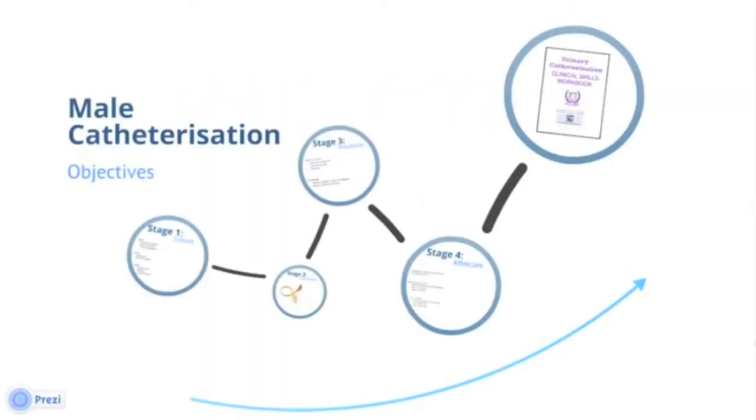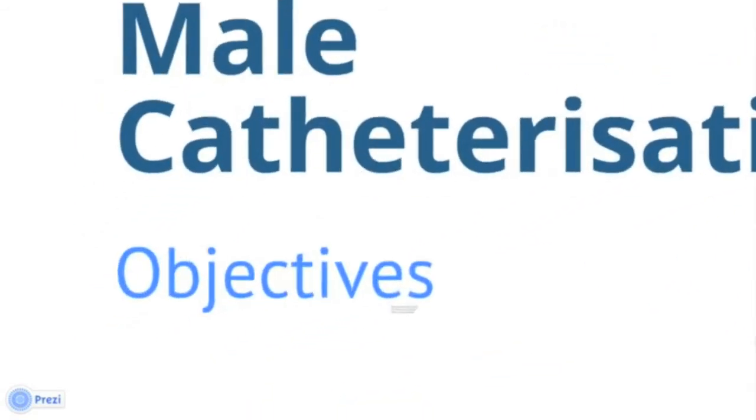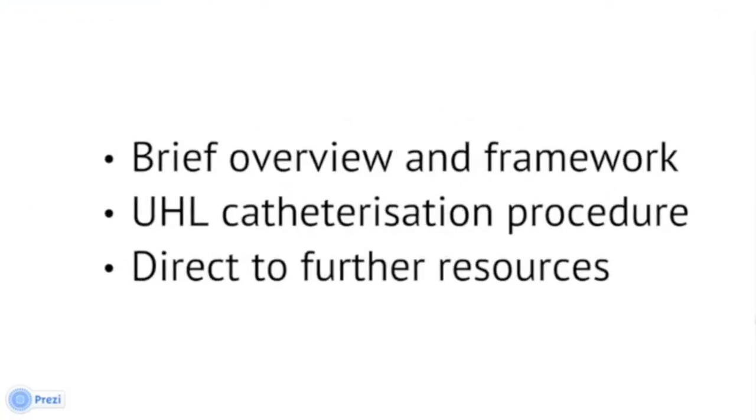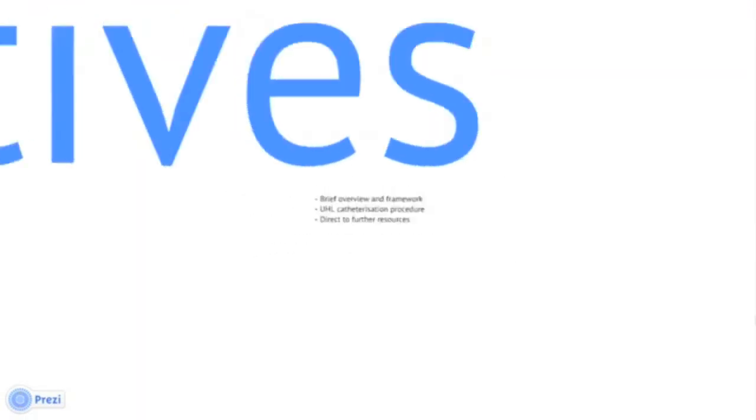This clinical skills video. Today we are going to be focusing on catheterization. The objectives of this video are to provide you with a brief overview and framework for performing the catheterization procedure following the UHL guidelines. We will also direct you to further resources which contain more detailed information.